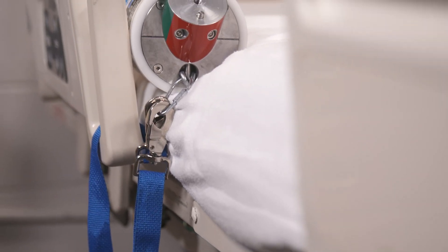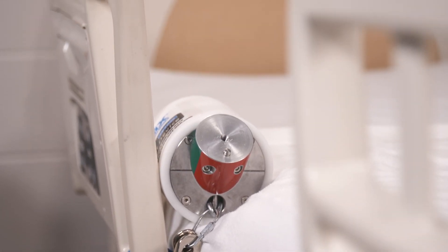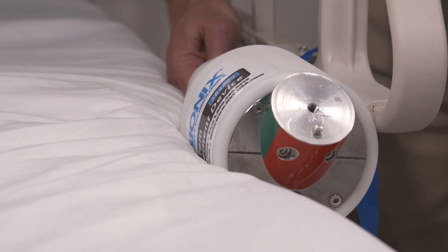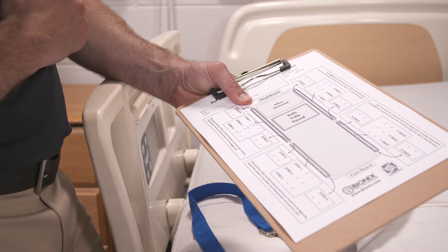If the horizontal line on the cone is above or even with the top surface of the mattress, the space passes the test. If the horizontal line is below the top surface of the mattress, the space fails the test. Record your results and repeat this test on all rails in all positions.